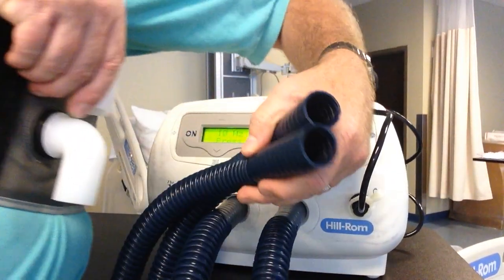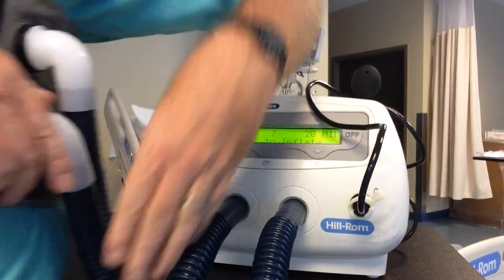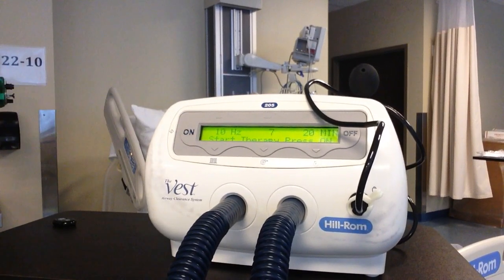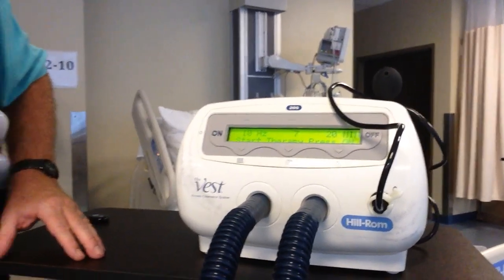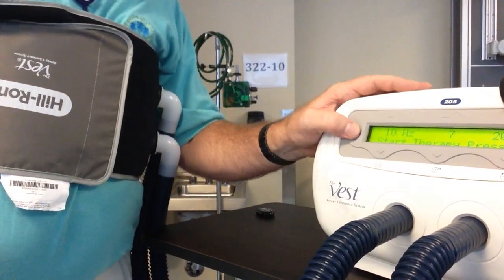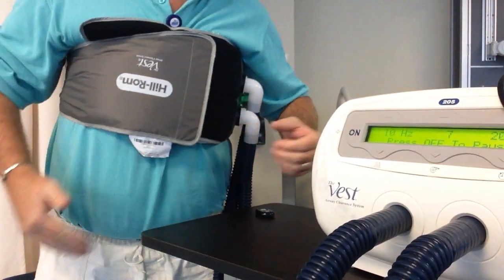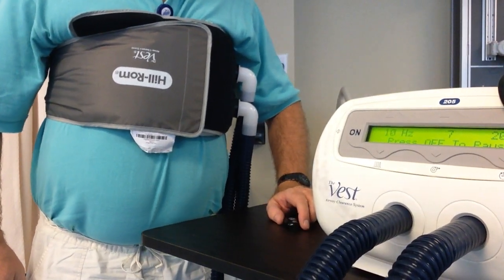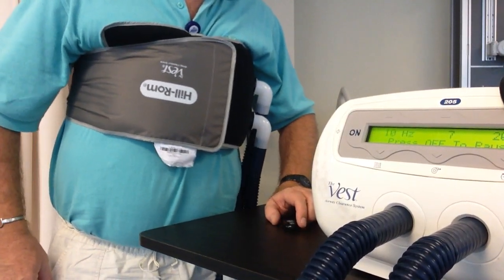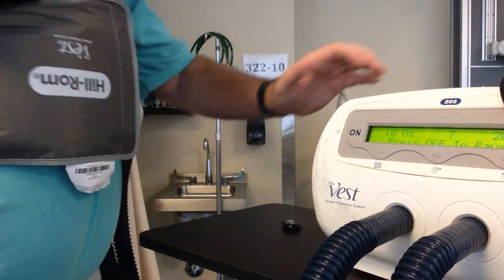Do a little twist. I will hook my hoses up to the side. And then I'm going to turn it on. Once I turn it on, my vest has inflated. It's gotten big, and then it says start therapy, press on. So I can press on. Now you want this high enough so it does not hit their diaphragm. And then the patient will do the therapy. And that is how you do the therapy.